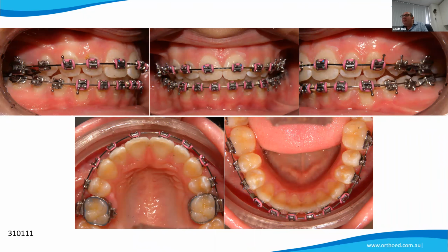That would probably help. But I think it's an issue with the prescription on our molar tube here. Back in those days we used to use a very high rotated molar, which is great for class 1s, but not great for this type of situation.